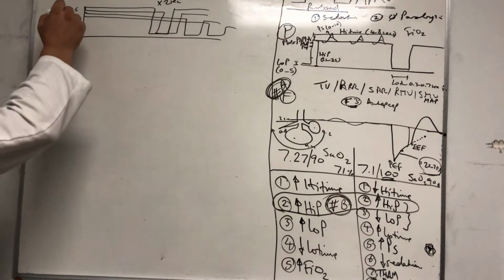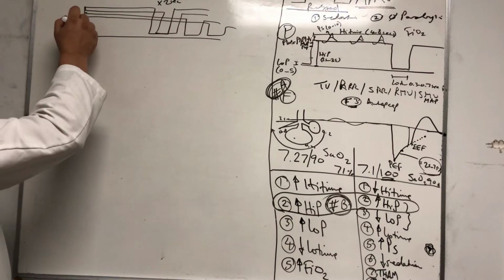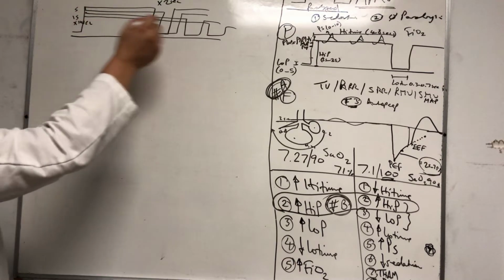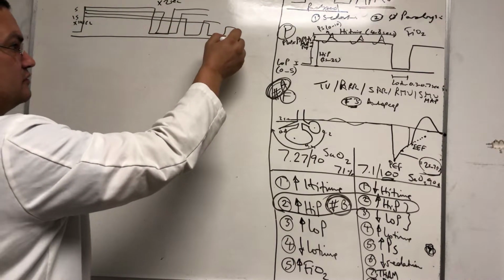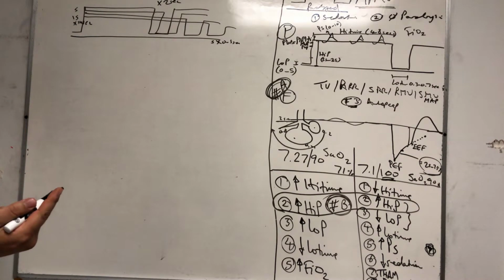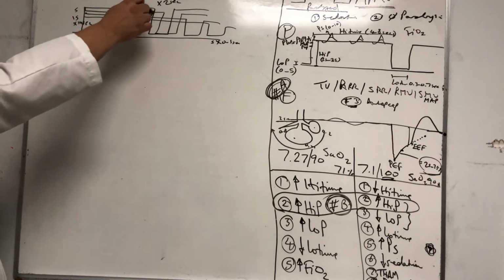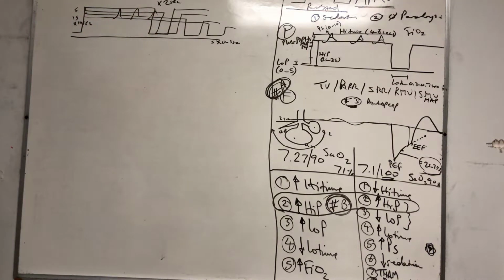Imagine if this is like 15 times 14 seconds, and this one is 5 times 0.5 seconds. What is the breathing? We're not breathing for the patient at all. We're just, every 14 seconds, making one breath, and he's breathing on top, so his breathing is mainly the one on top. We're giving him only four breaths per minute, and the height of those breaths is from 15 to 5, which is not a big deal. So for those, you add the pressure support to them, if they need, right? And you wean that way.